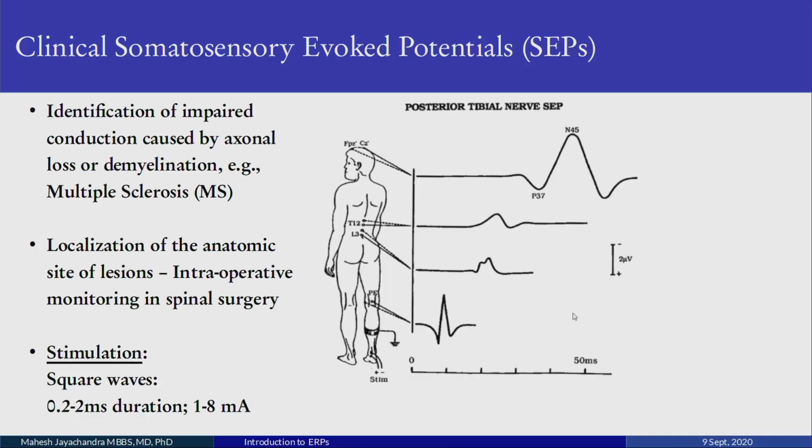Okay. So we finish auditory, we finish visual. Now we come to the somatosensory. Here we give a brief electrical pulse either to the ankle, or we can give it to the median nerve at the wrist. And we monitor the potentials as it goes up to the brain. Okay. So right over here at the knee, it's very early. Then at the lumbothoracic spine, it's a little later, and it gets more delayed as it goes up. And finally in the scalp, the brain, you have the somatosensory evoked potential.